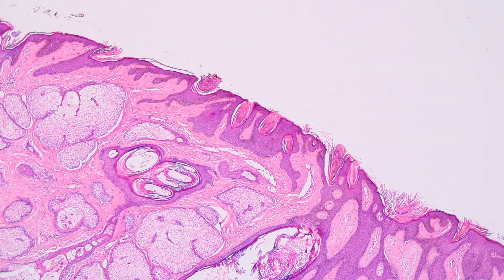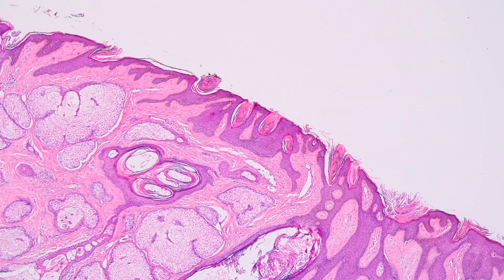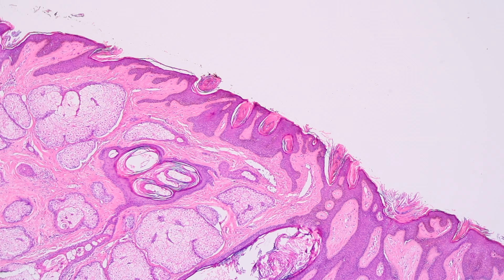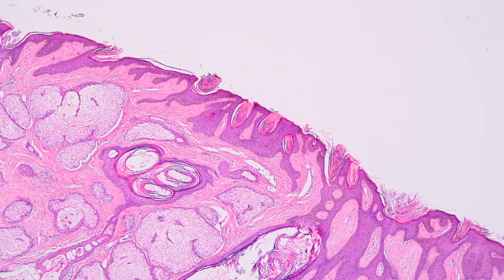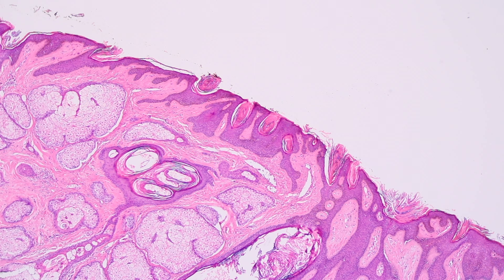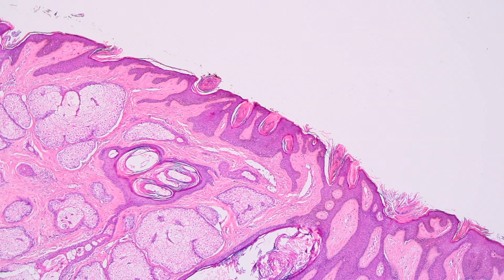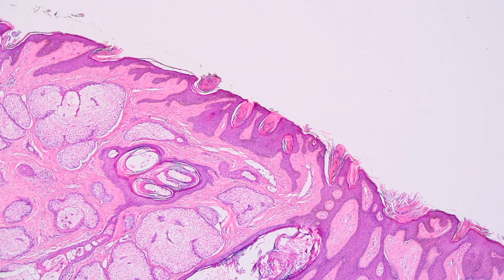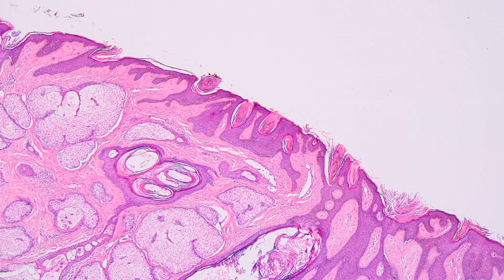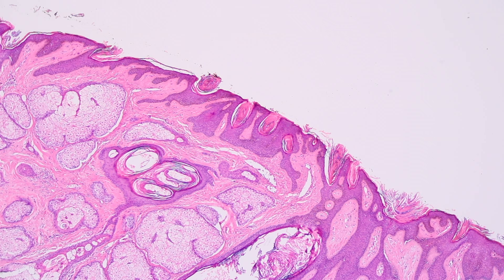The clue here is that this is from a 16-year-old patient. It's very unusual for young patients of that age to get seborrheic keratosis. In my experience, most seborrheic keratoses I see in practice are in patients usually 30 or older. If I see someone in their teens or early 20s with something that looks like a seborrheic keratosis, I stop and think: could this be a nevus sebaceous that doesn't have a well-developed sebaceous gland component? Or could it be an epidermal nevus — a hamartomatous process involving just the epidermis with warty, acanthotic-looking epithelium but no adnexal component?